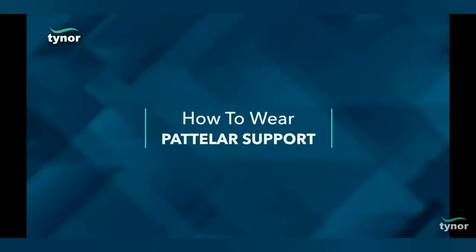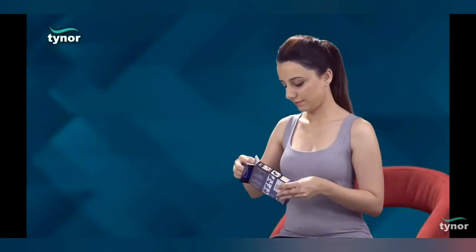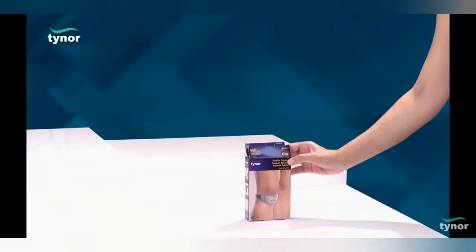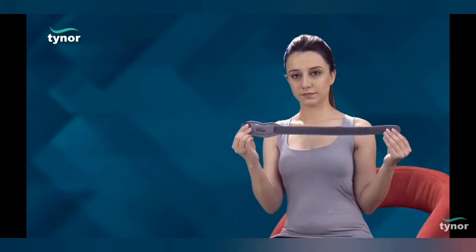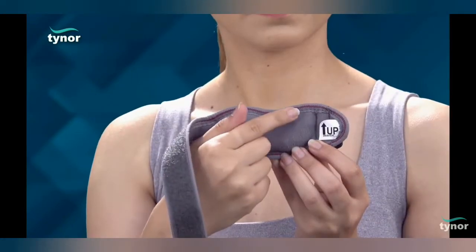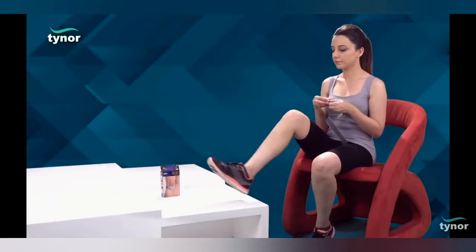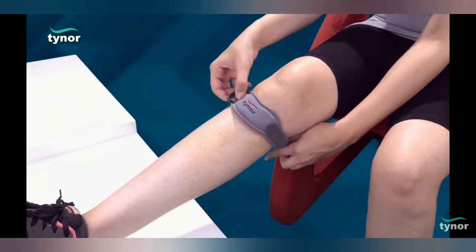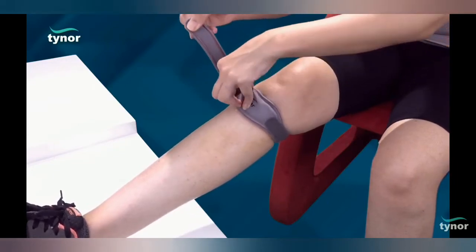Now, let us see how to wear the patellar support. See the inside-up label for correct position of the product. To position the product correctly, place the upper curve of the product immediately below the patella. Tighten the strap to a comfortable level.